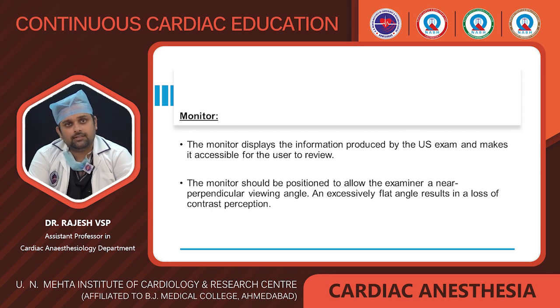Coming to the monitor. The monitor displays the information which is produced while doing the ultrasound exam, and it makes it accessible for the user to even review later. The monitor should be positioned to allow the examiner a near perpendicular viewing angle, because an excessively flat angle results in loss of contrast perception.